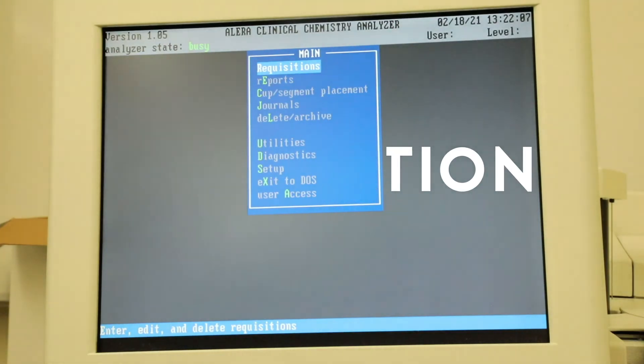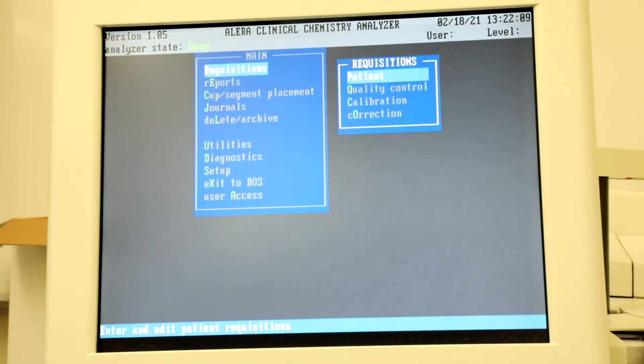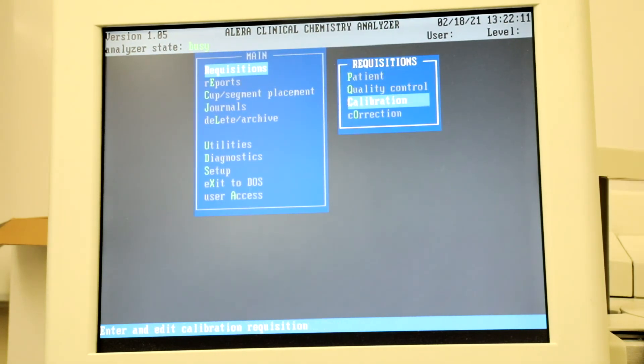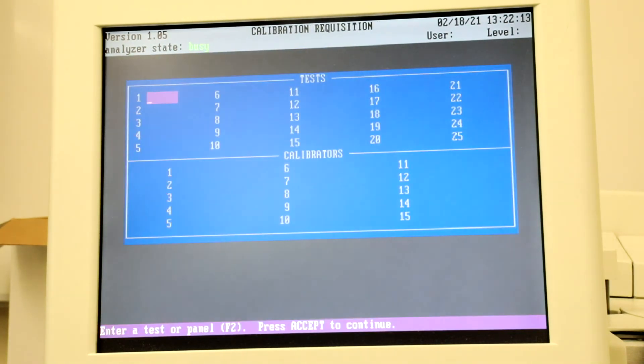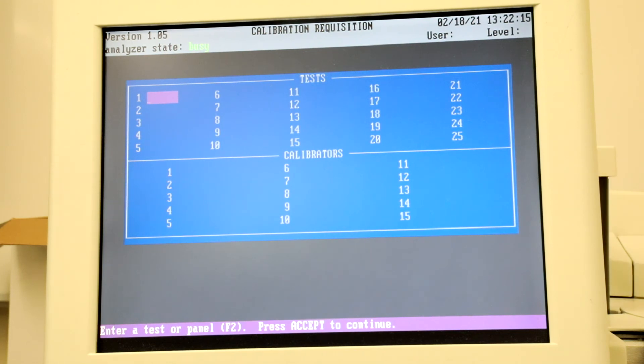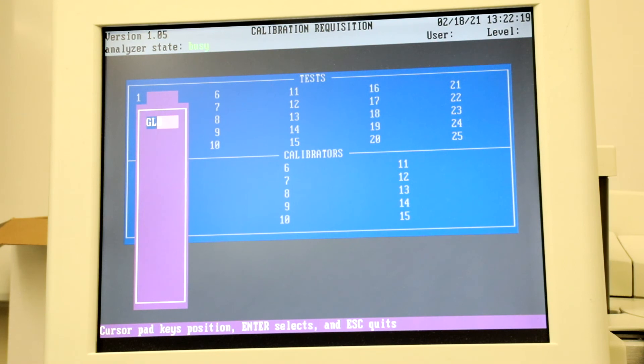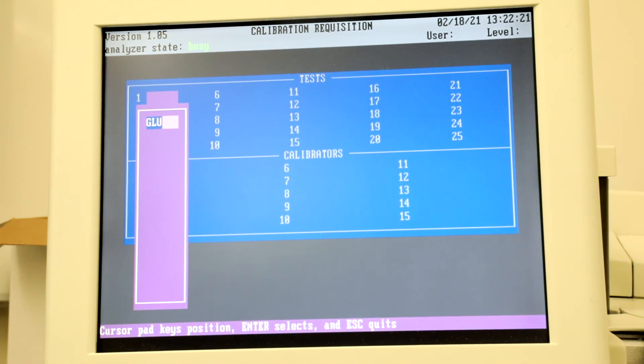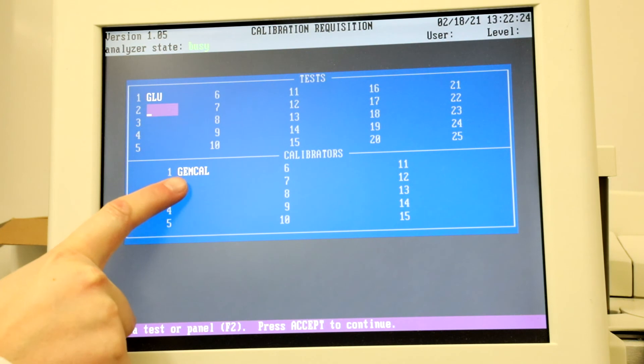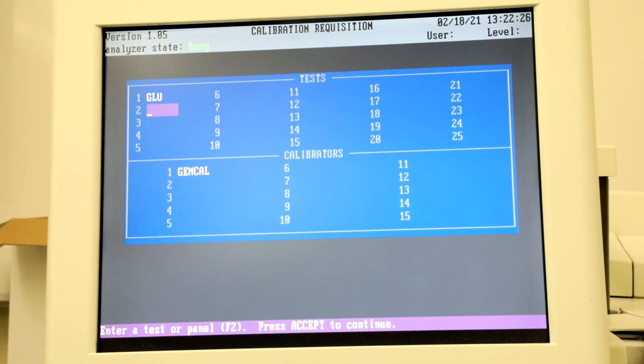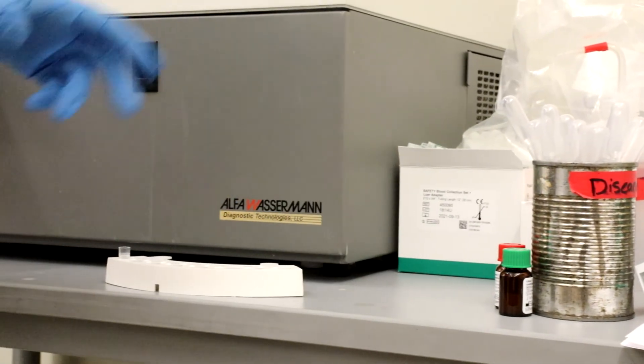If an analyte needs to be calibrated, select R for Requisition and then C for Calibration. Enter in the abbreviated name of the analyte or hit F12 to pull up a list of all analytes. Once you have entered in the tests that need calibration, the name of the calibration will be displayed. Find the appropriate calibrator and place a few drops in a cup.